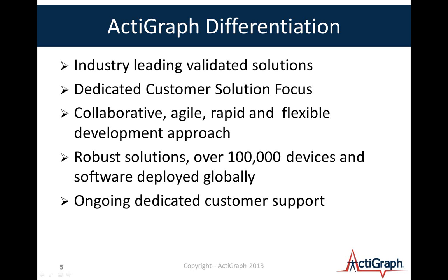The other thing I would mention that's not really on this slide is that we've got a lot of experience in putting devices on people over a 24-hour period, and what that buys you as a user is 24-hour monitoring, both activity and sleep together. That really enlightens people who are looking to monitor chronic disease states like diabetes or cardiovascular issues or pain or asthma, and so our solutions are able to reach a broad chronic disease base as well as a research base. Just a broad-reaching company, and we're proud of that background.